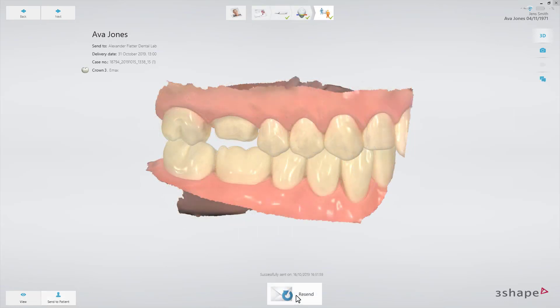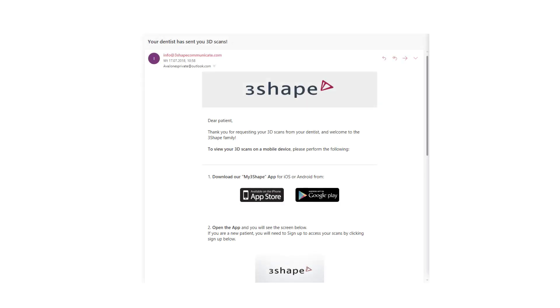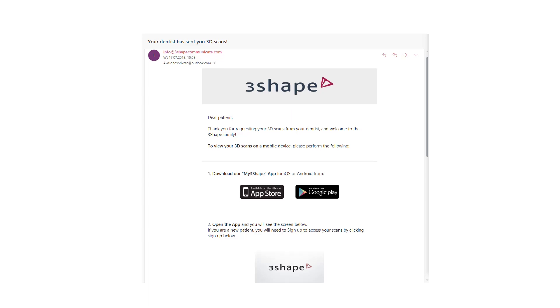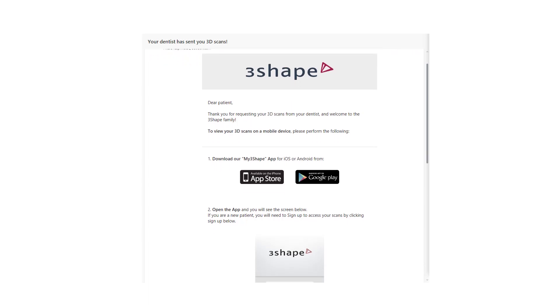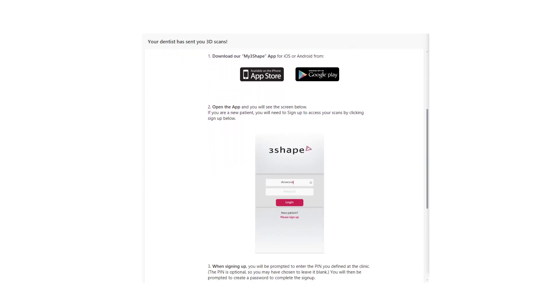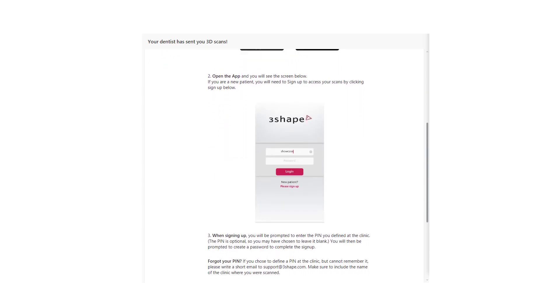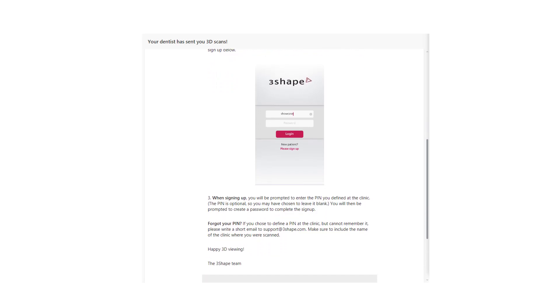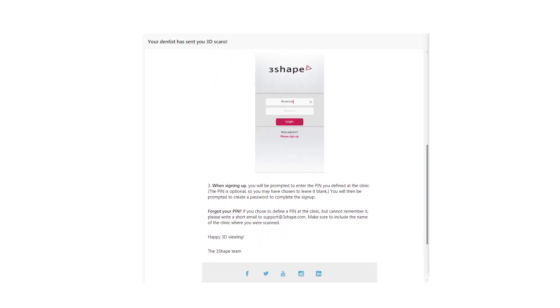Labs will find the case in their Trios inbox. The patient will receive instructions by email that the scans are now available, and be told how to access them through the My3Shape application. By using the My3Shape application, the patient will be able to see the scans on a smartphone.